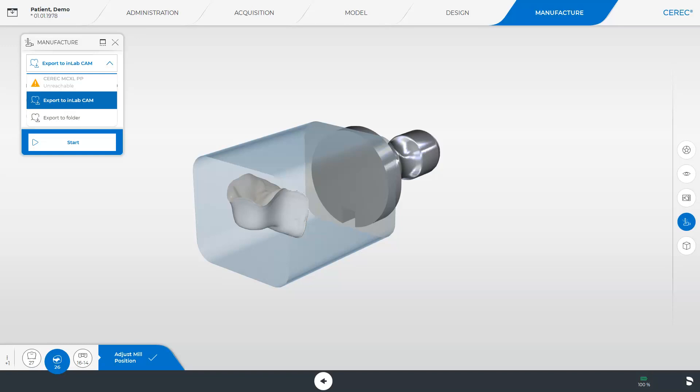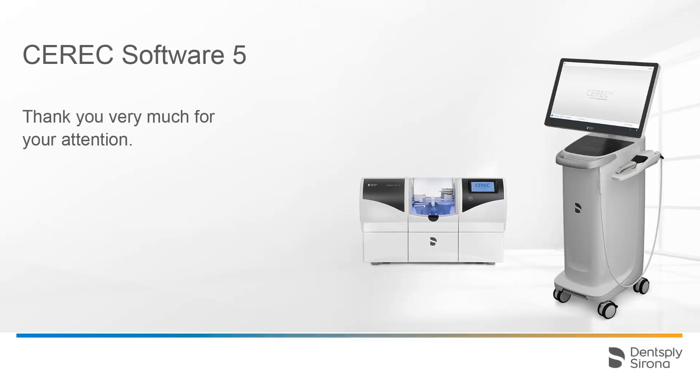Regardless of which option you choose, you will need to confirm the procedure by tapping Start. Thank you very much for your attention. We would like to wish you every success when working with CEREC.